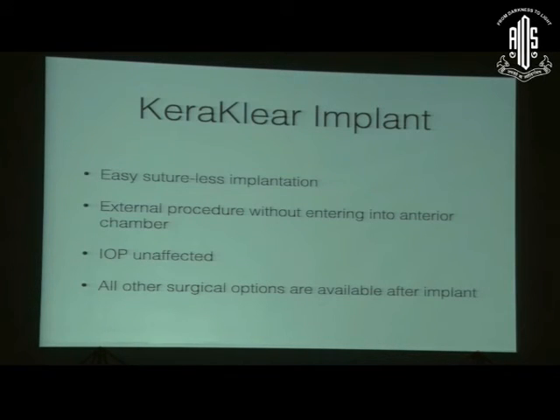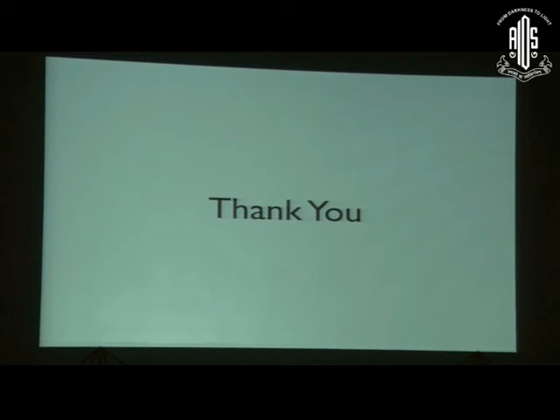So the advantage of using a femtosecond laser is that it's a sutureless implantation, an external procedure without entering the anterior chamber. IOP is unaffected, and if not, you can always go back and do another surgical procedure at a later date. So by implanting this, you're not altering the outcome of any other subsequent procedure. So that's in short about the use of femtosecond laser and various intrastromal pockets.